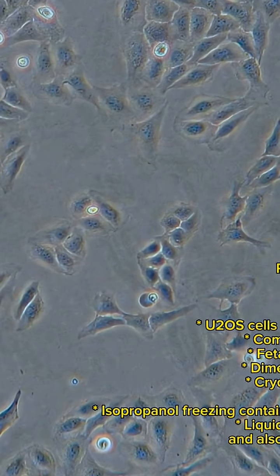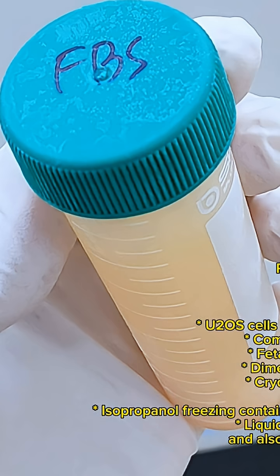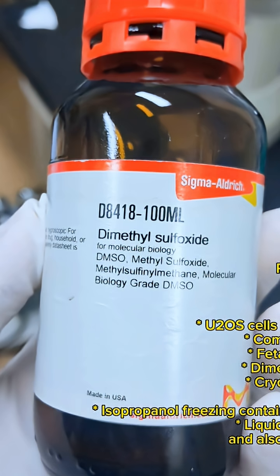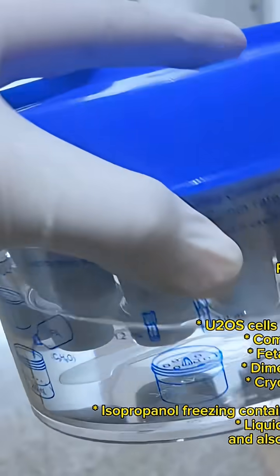Prepare materials. You'll need U2OS cells that are healthy and 70-90% confluent, complete growth medium, fetal bovine serum (FBS), dimethyl sulfoxide (DMSO), sterile labeled cryo vials, and a cryo box.